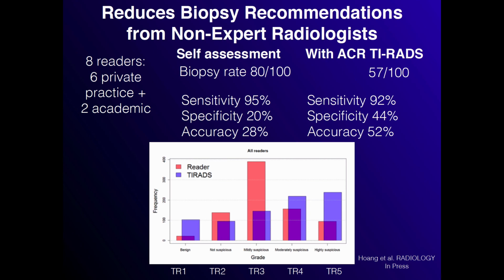What's your guess for why that is? I think that radiologists who aren't certain are going to err on the side of recommending biopsy, particularly when you sort of reach a size that makes them uncomfortable, like 1.5 centimeters or 2 centimeters. Yeah. Do you think so?